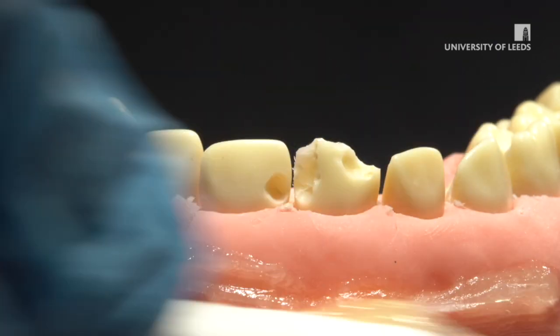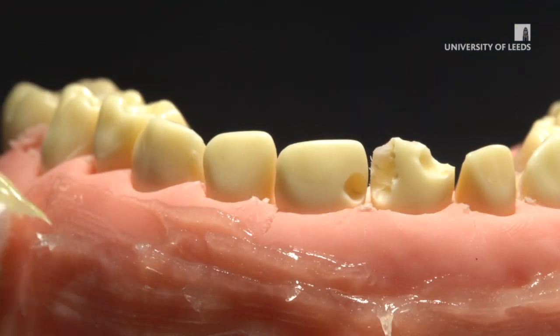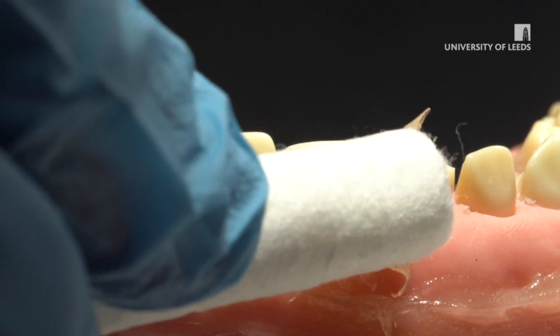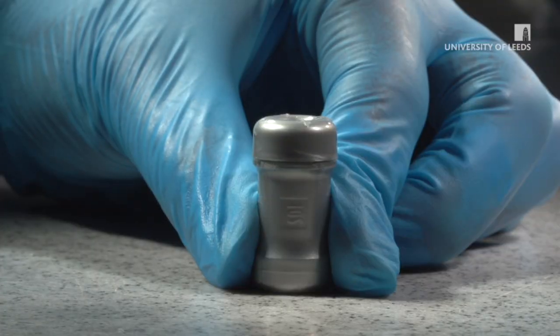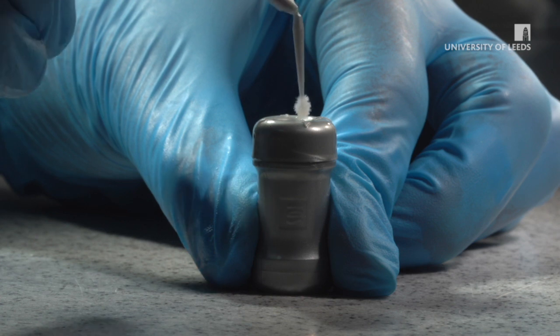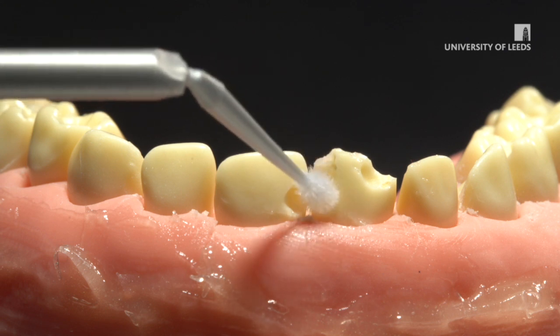After that, you need to isolate the lip and mucosa with Vaseline. Here I'm isolating all the mucosa and the lip around it, because silver diamine fluoride can cause brown staining for one to three weeks, which will fade away. Then you need to isolate the gingiva around the teeth you're applying silver diamine fluoride on. Just make sure that you do not coat the teeth that are going to have the silver diamine fluoride applied to them. Then grab a silver capsule, pierce it open with the grey microbrush, and carefully apply it on the dental caries on the cavitated lesion.